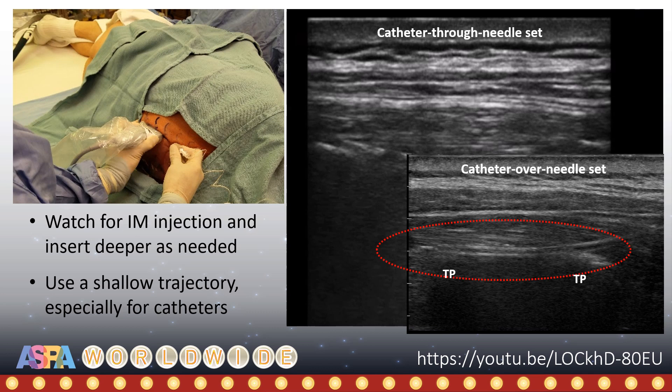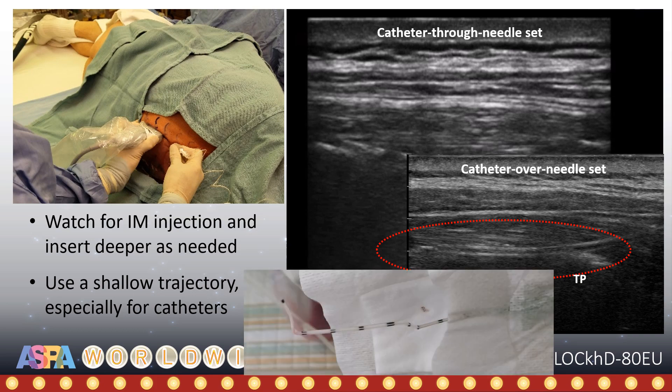If using a catheter-over-needle set, it is ideal to take advantage of the hydrodissection to drive the needle-catheter assembly all the way towards the next transverse process, thus ensuring an adequate length of catheter in the fascial plane to prevent dislodgement. This shallow trajectory also minimizes the risk of catheter kinking from muscle contractions and movement that will otherwise result in occlusion and high pressure alarms with infusions.